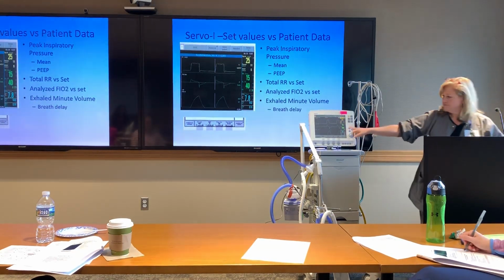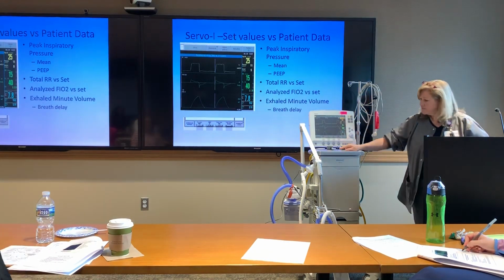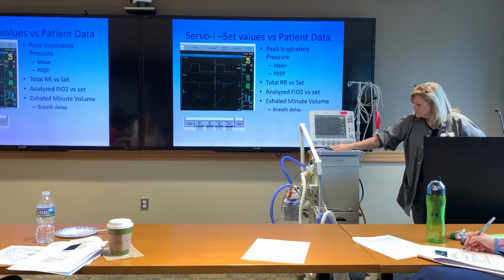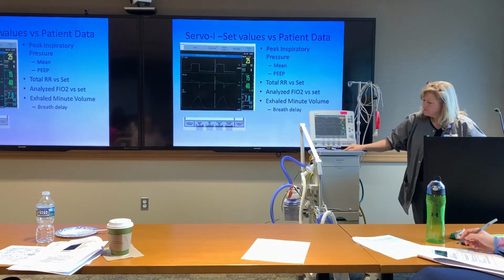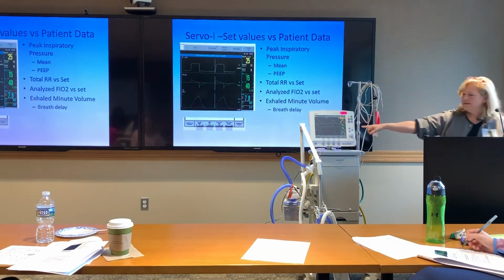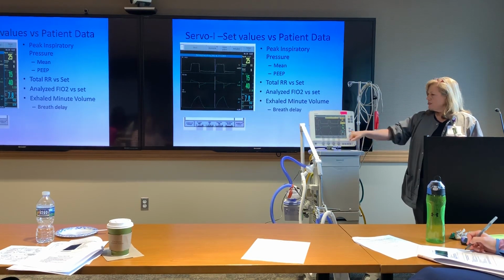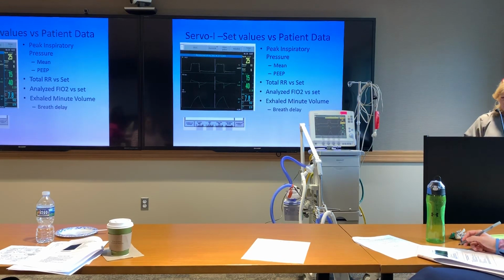Anyway, so the difference. You can see this is now finally up to 100%, but it took a while. And I'm going to take that off. Exhale minute ventilation, I already kind of told you about when we talked about blood gases. This is the total minute ventilation the patient should have. It's just a good thing to keep going about, and I think that's enough on that slide.